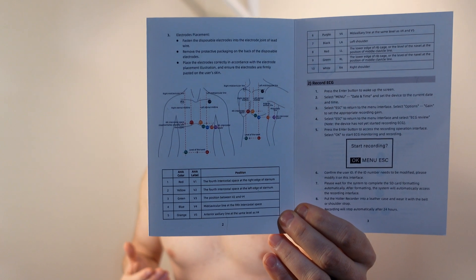Next we need to put on the electrodes. They give you 10 in the box, but only 10, and they are not reusable — they're disposable — so if you need more that's going to be a problem. They do give you a nice color guide showing where everything should go. Starting at position one, it's kind of right above the nipple. They do say you should shave any hair, but I'm just going to use it as-is.